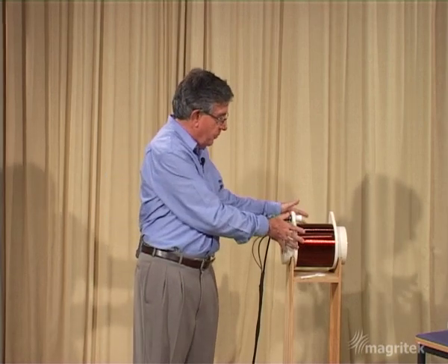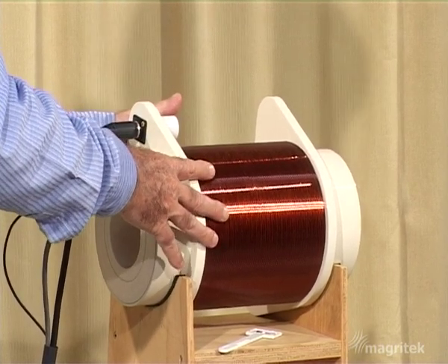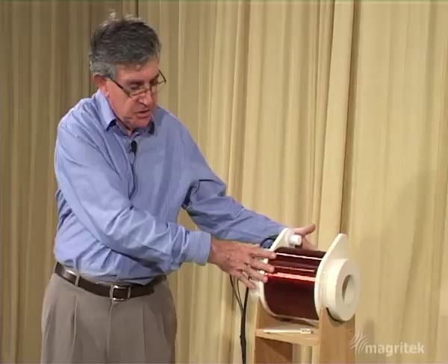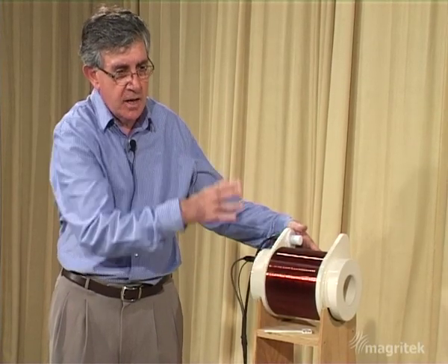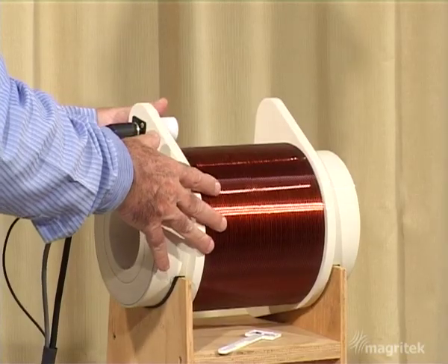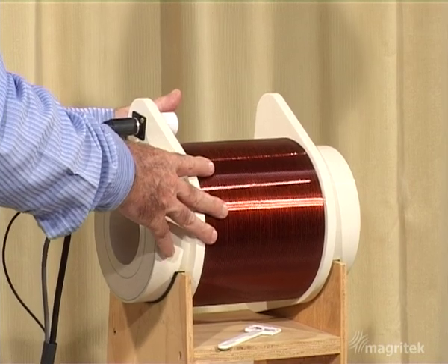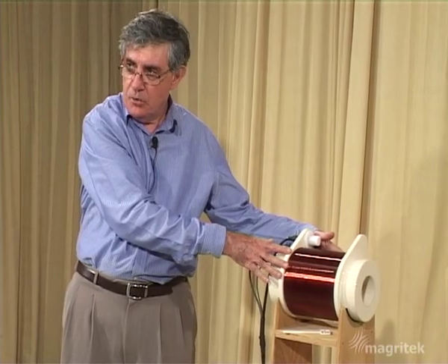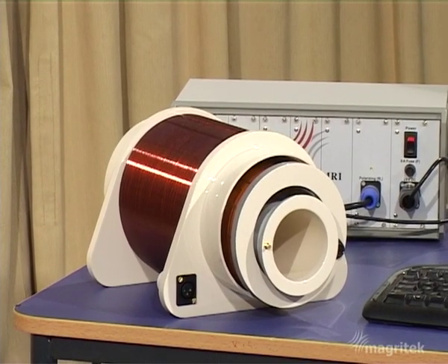Coming back to that oscillating transverse magnetic field — that's produced inside the probe of the Terra Nova apparatus. The probe is really the heart of the instrument. It's driven through a cable from a spectrometer, which is in turn controlled by the computer. In fact, the Terra Nova probe is a bit like a Russian doll: it's got a whole lot of layers of coils inside it. We've got over here a disassembled probe where I can pull out the components very easily.